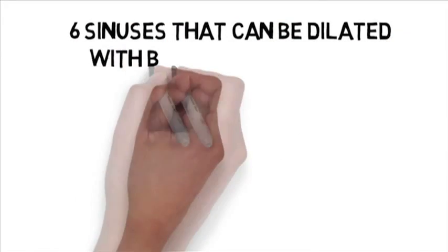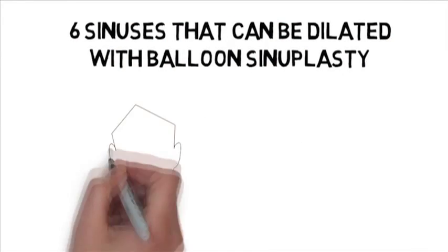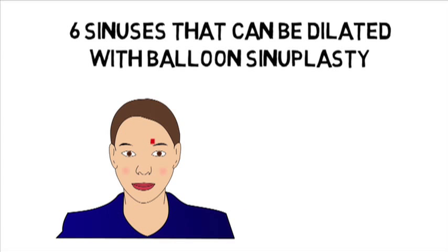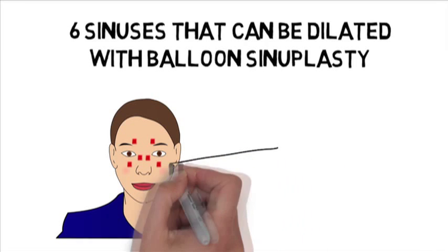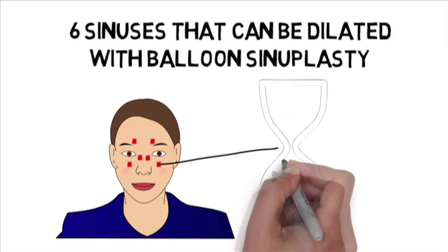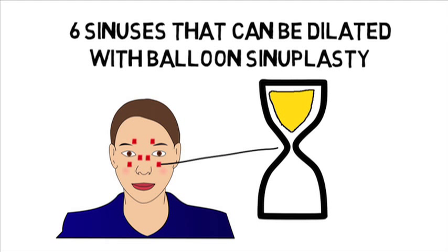There are six sinuses that can be dilated with balloon sinuplasty. All of them are more or less shaped like an hourglass. Usually we find a backup of mucus at the bottleneck.